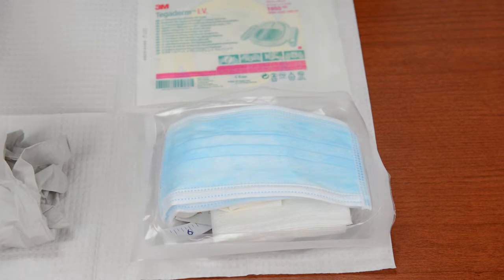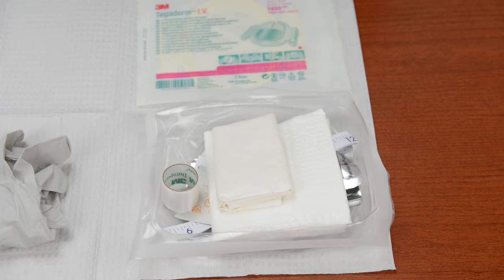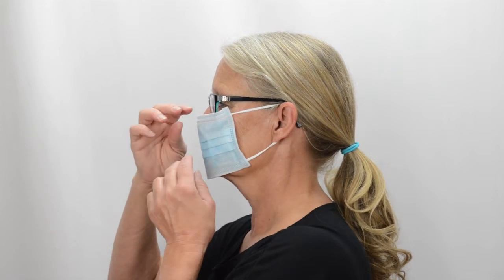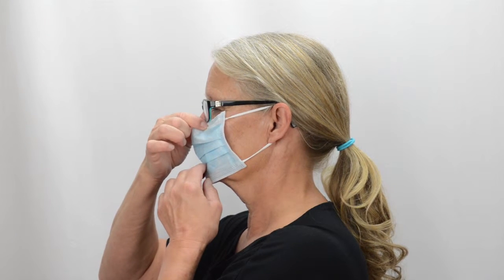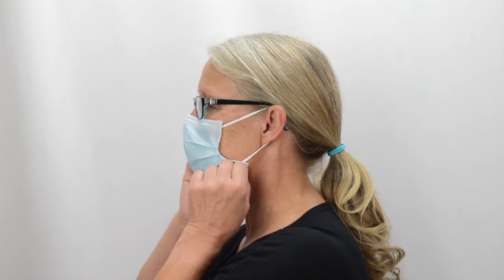Carefully pick up the two masks from the top of the tray, making sure not to touch any other item in the tray. If another person is helping you with the bandage change, have them put on the other mask. Place the white side of the mask over your mouth and nose with the metal piece on top. Pull the elastic loops around your ears, pinch the metal piece over your nose, and gently pull the bottom of the mask under your chin to fit the mask to your face.